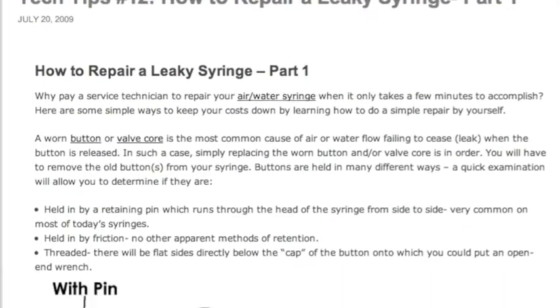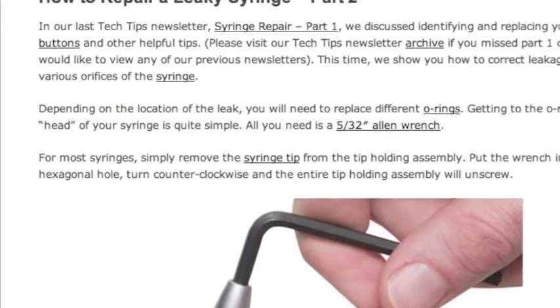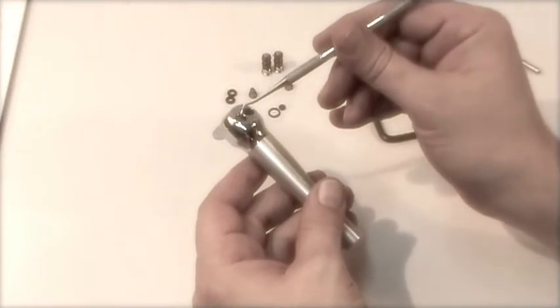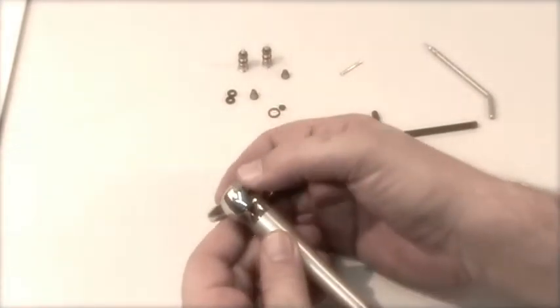In previous editions of our Tech Tips newsletters, we've covered the reasons air water syringes leak and how you repair them. But because syringe repair is so simple, we offer this video of a complete syringe rebuild as a companion to those newsletters, to show you that anyone in the office can do it.